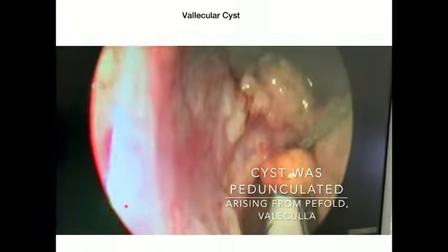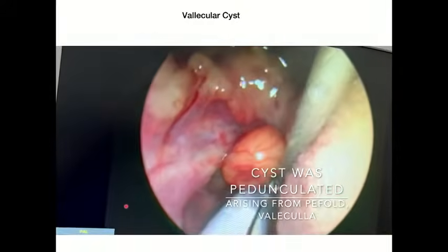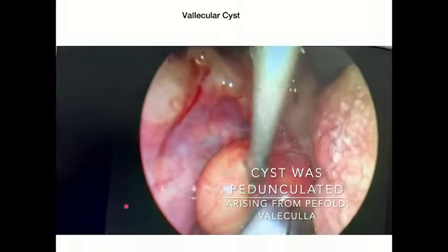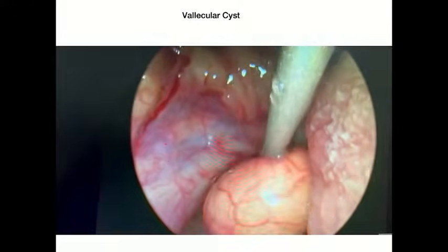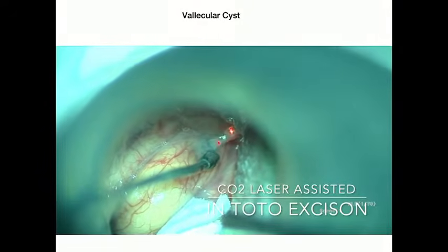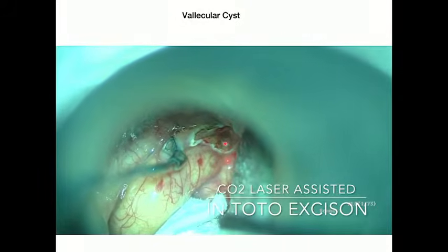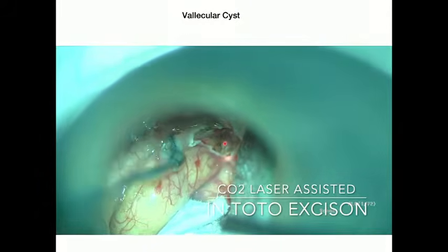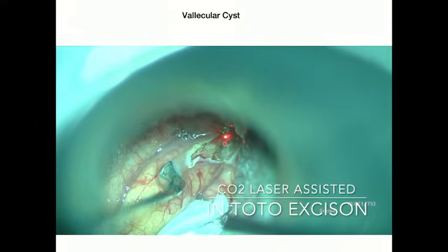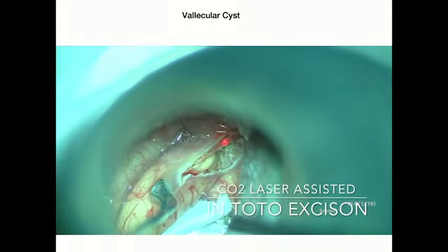The instrumentation is very important. So when you are doing supraglottic or base of tongue surgeries, the Lindholm scope is a very good scope to use, and for vocal cord it's the Dedo scope. So I only use two scopes, Lindholm for supraglottic and base of tongue and Dedo for the vocal cord work. So it's very important to use an endoscope and evaluate the lesion, take pictures to discuss with the family, make them understand, and then palpate the lesion and see.